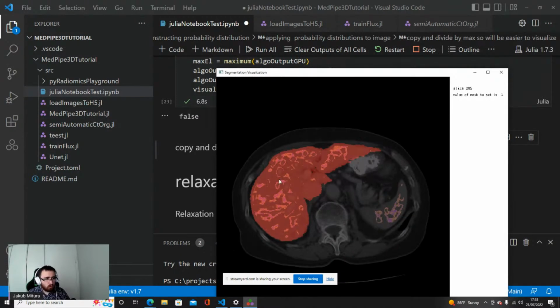But we know one thing: if there is a point that has high probability of the liver from each side, it's probably a liver. If you are here, for example, from all sides there is a high probability of liver, so probably this is all the liver.